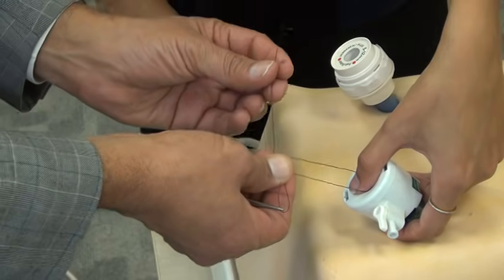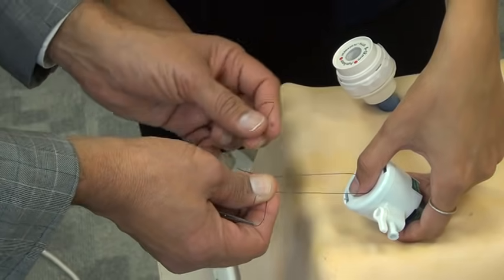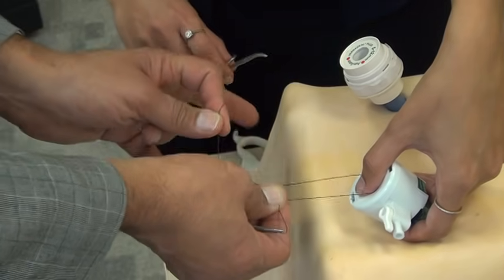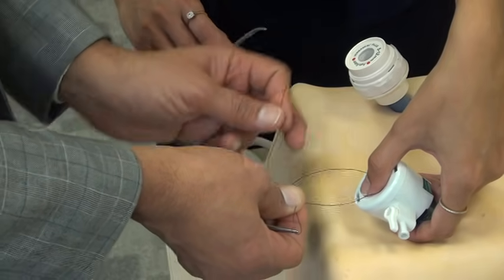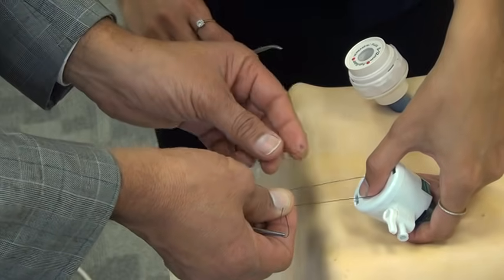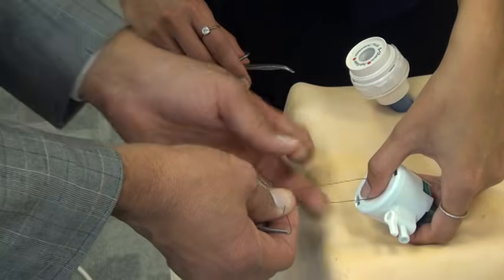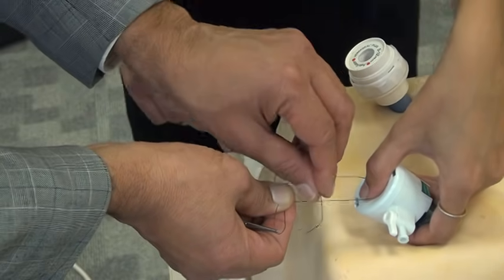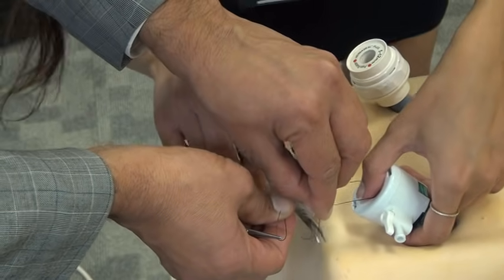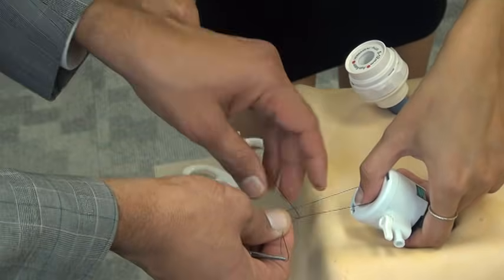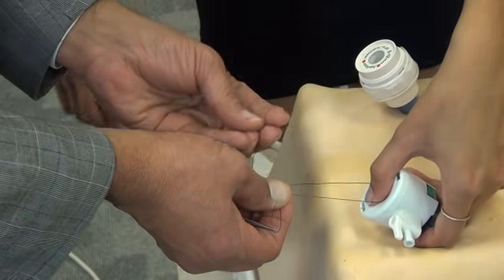And now this end is short. So rather than struggling, have your assistant ready with a second clip. So each time you throw, your assistant will pick it up from bottom. So two, 360 degree circle, there we go, the first one.